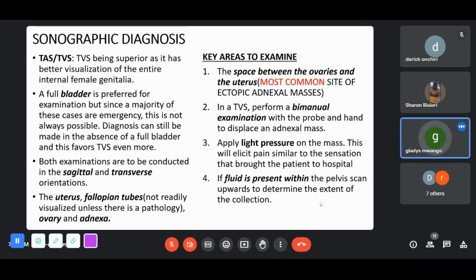Sometimes you'll not be able to see the entire cervix. Panning is always important whenever you are doing your ultrasound, moving your probe from side to side and up and down, so you're cutting sections through the structure of interest, so that you don't miss any lesion. So you don't just get one image and freeze. You should sweep first before you get the image. Then you go transversely, and then you can get your images.